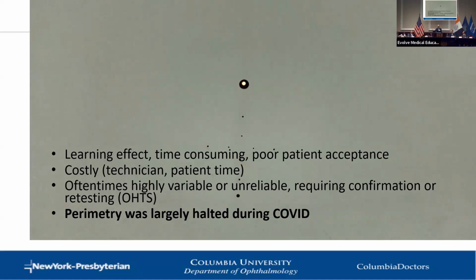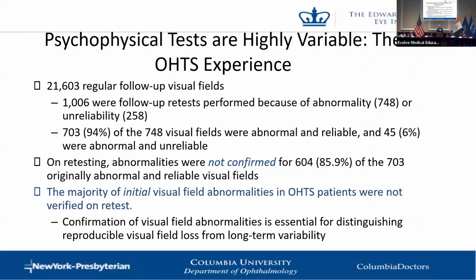I assume everyone in this room has had a field. If you haven't had a field, you need to perform one immediately on yourself to understand what the patients are going through. There's a learning effect. It's very time consuming. Hopefully there are new technologies coming around the bend with using virtual reality and other things that might help us. Remember, perimetry was largely halted during COVID. I'm not sure that mattered all that much to our glaucoma patients.